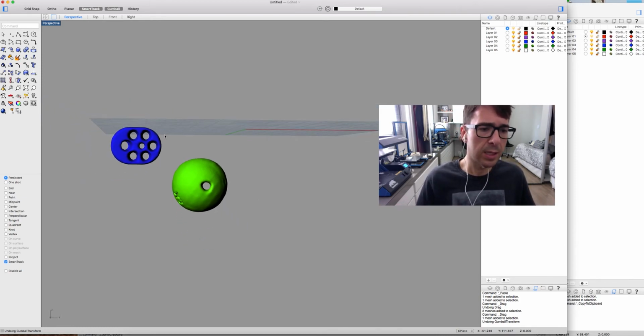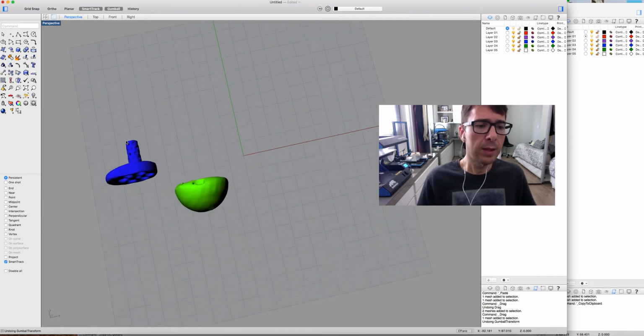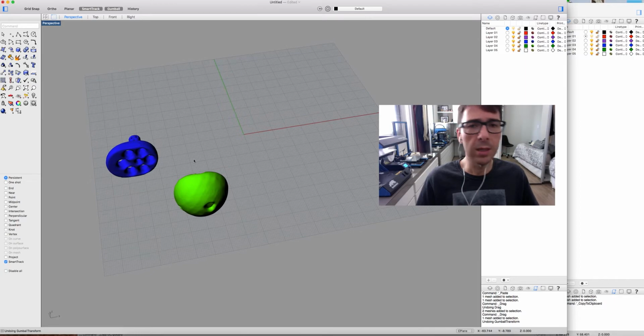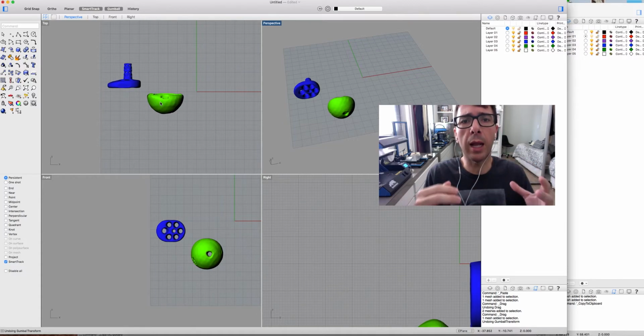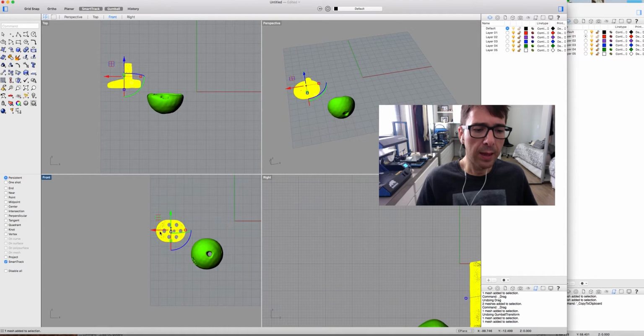So this is the actual implant. You can see this is oval. The central pin is not in the central part, and we're going to use this implant as reference. We could actually use the actual implant for planning, but we always prefer to use our designs because they are cleaner and easier to work on. So here we have the glenosphere and the base plate.